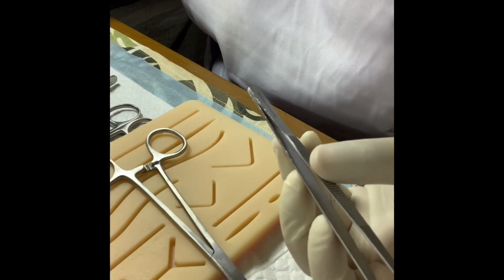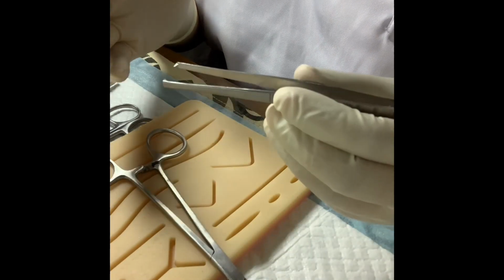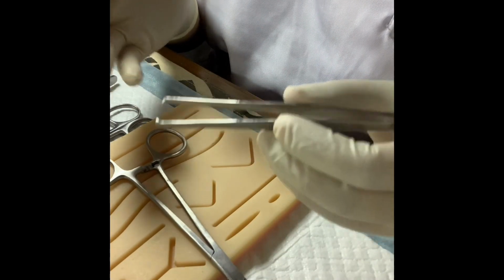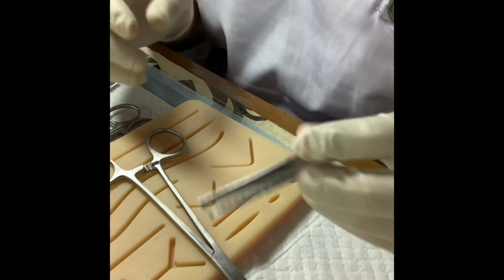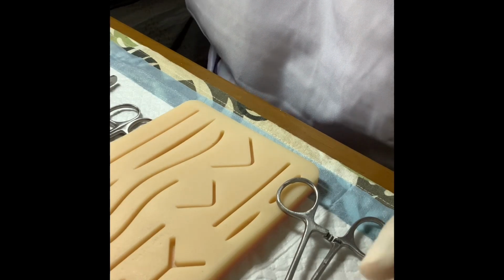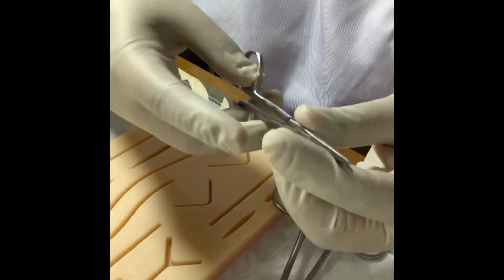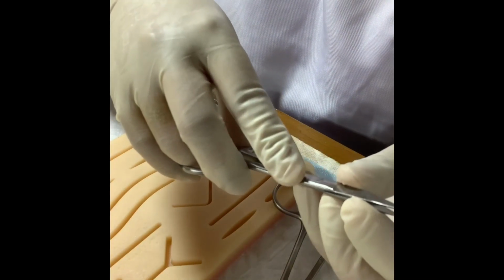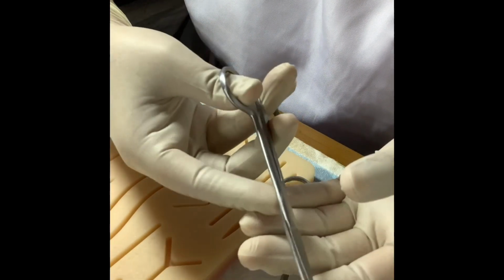Next is the tissue forceps. Use your non-dominant hand while holding it and hold it the same way we are holding a pen, like this. We will also be using scissors. Put your thumb and ring finger on the handle and the index finger at the base for precise movement and for cutting the sutures.